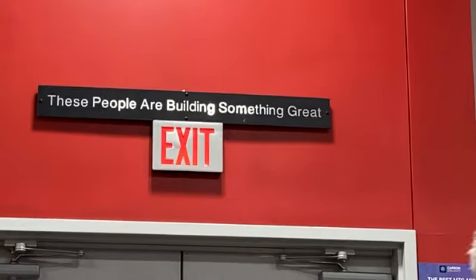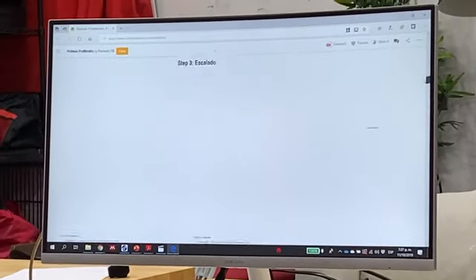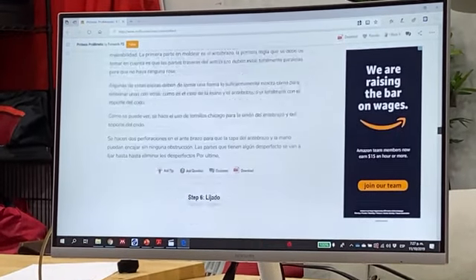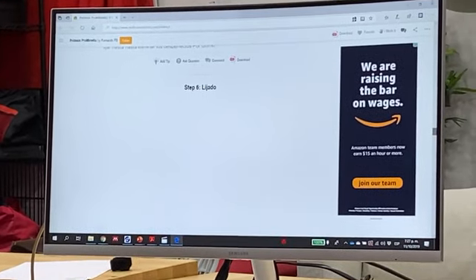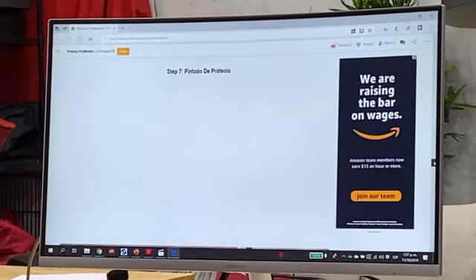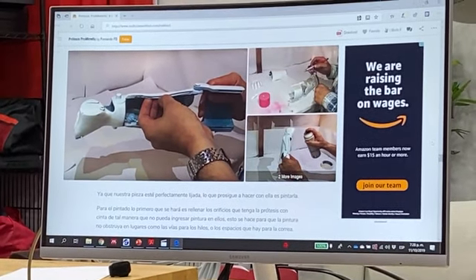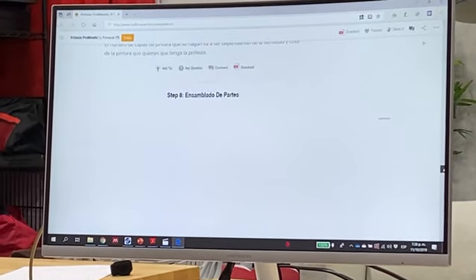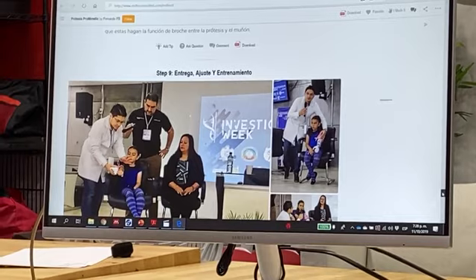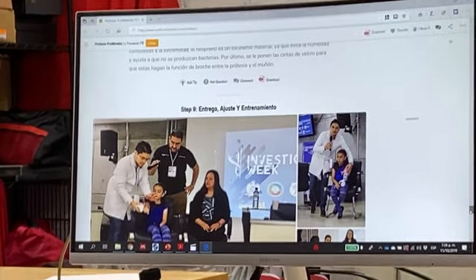Unfortunately, the internet is not working well, but there are lots of videos where we show how to make the whole process, from the scan to the 3D printing, and to the thermoforming, and the assembly, the sanding of the pieces, and how to decorate and paint the prostheses. So there are videos that show it, and the assembling of the prostheses as well. Sorry, the internet is not working. And then how the prosthesis is fitted and trained as well. So there are 9 steps that I propose as a protocol to bring a prosthesis to a child, right?